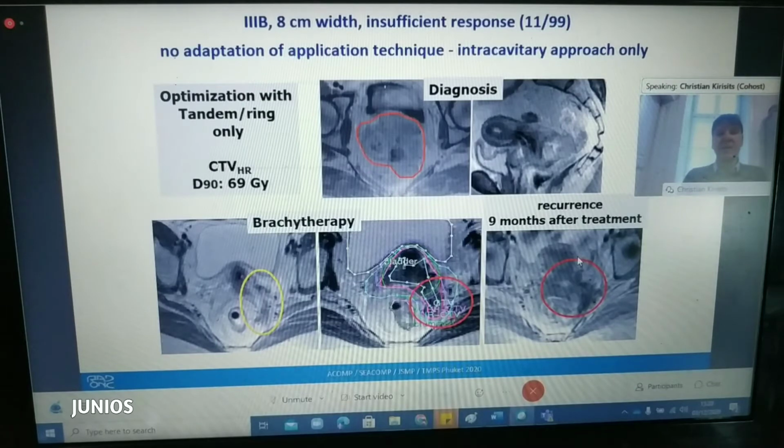The patient died. This is for me such an important issue because it shows that we had MRI, but the MRI only did not change the practice. Only when we started to contour appropriately and when we also changed the irradiation technique.